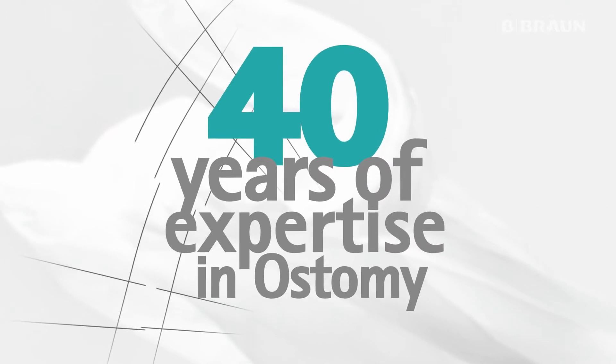With 40 years of expertise in ostomy, B. Braun has developed a new two-piece mechanical coupling system: Flexima 3S. The innovation is based on the success of the Flexima Key concept, aiming for an easy and intuitive setup.